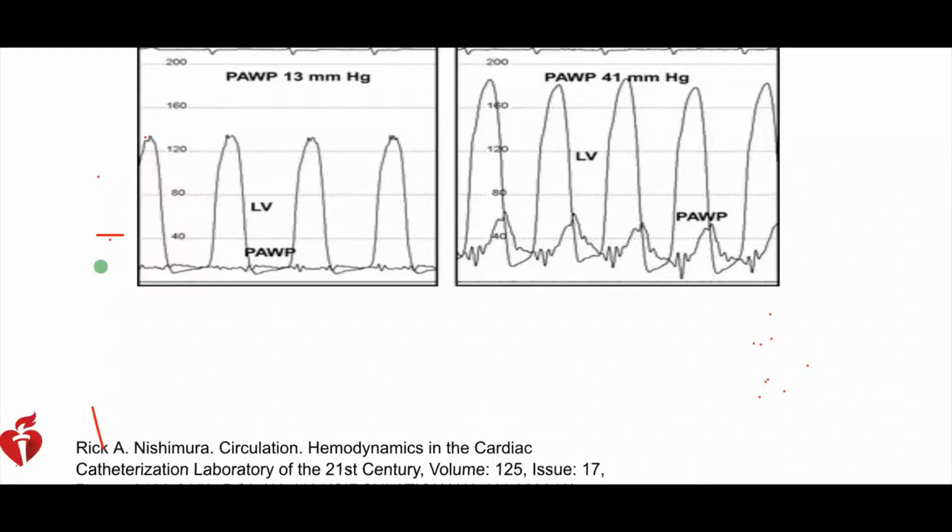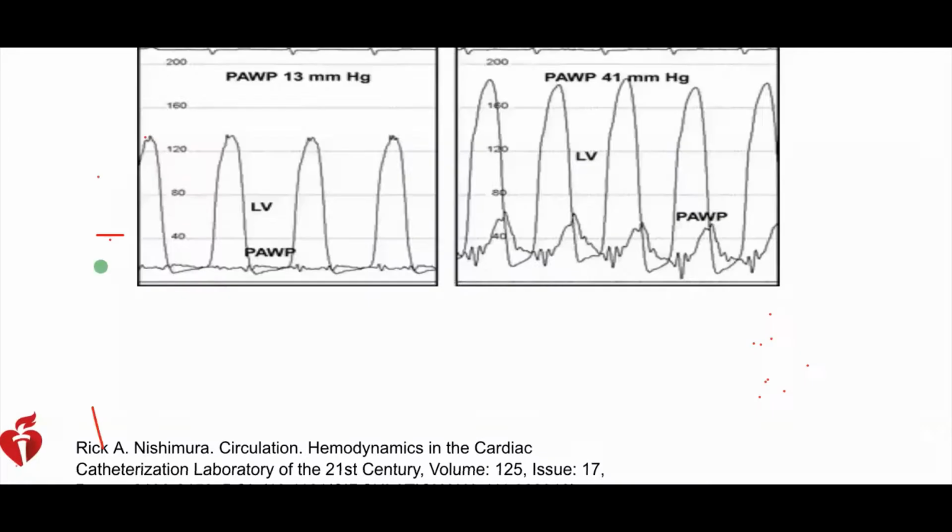But now, since 2016, in the guidelines, let me just note. Okay. So in the guidelines from 2016, they have spoken about diastolic reserve testing and the diastolic stress test.